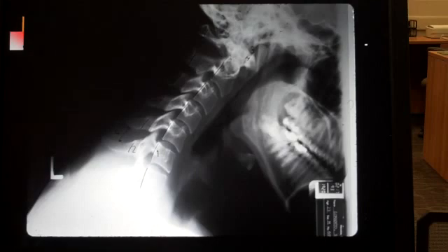The view that I am discussing today is the lateral flexion view. Besides the bony structures that we normally look at on the routine lateral view, we have four things that we want to concentrate on in the lateral flexion view, and they are numbered on this film.